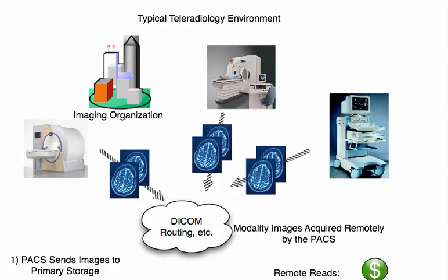A lot of these teleradiology organizations have been providing the value-added service in the form of remote reads for many years for a lot of their clients, and their clients are saying, look, we've been shipping our data around to you for so many years. You've been providing these value-added services in diagnostic reads. Why don't you just provide our long-term storage and preservation of our diagnostic study, the archive, if you will.